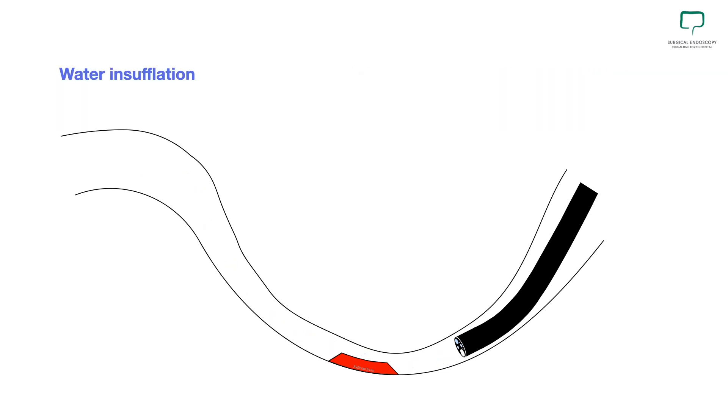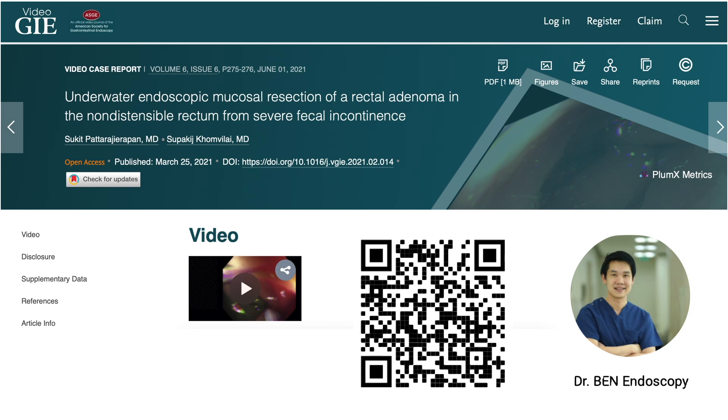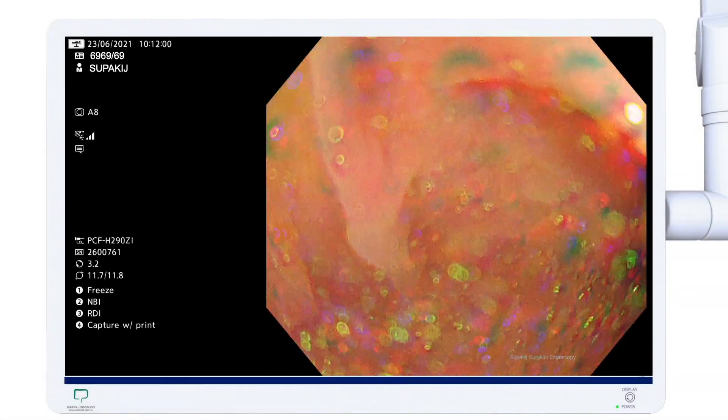But with water insufflation, water stays in only one part of the lumen and we can solve this problem. So if you face the problem with bowel contraction or difficulty distending the lumen, just put water in and you will see. I learned this technique from my colleague Dr. Sukit, or Dr. Ben — he also has a video case report in GIE, please check it out. This is the example in sigmoid colon.